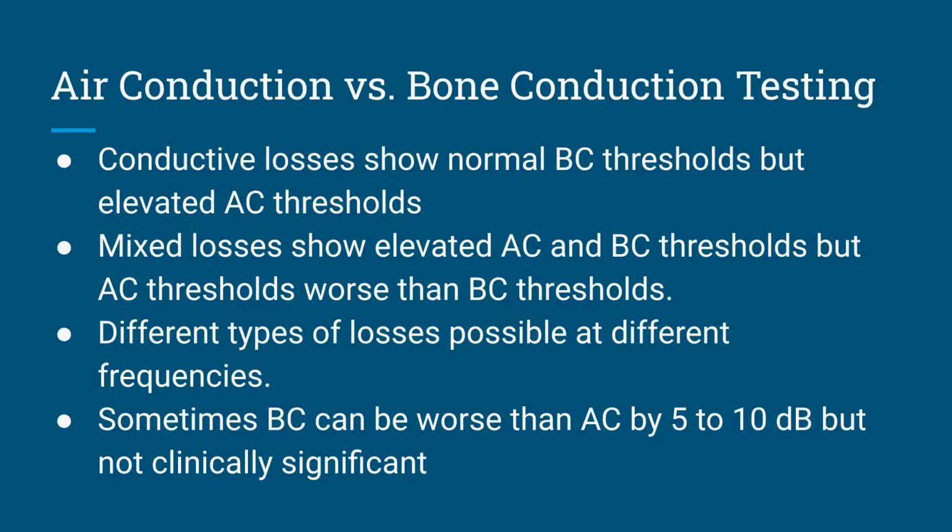There are different types of losses possible at different frequencies. You can have a mixed loss at one frequency, sensory neural loss at another, and then normal hearing at another, or conductive loss at another. So you can mix and match different types of hearing loss for a given audiogram.